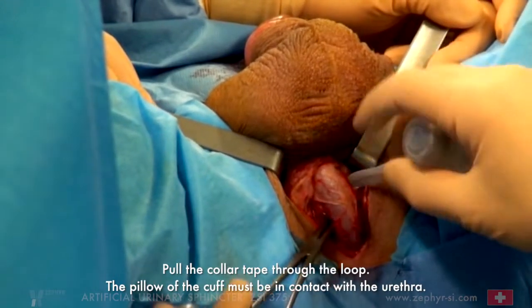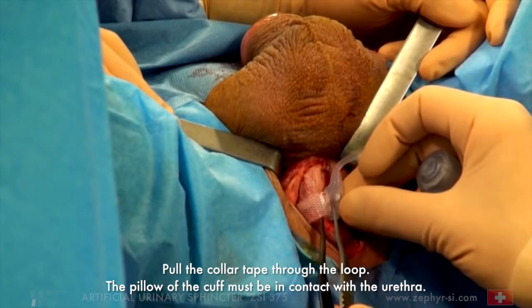Pull the collar tape through the loop. The pillow of the cuff must be in contact with the urethra.